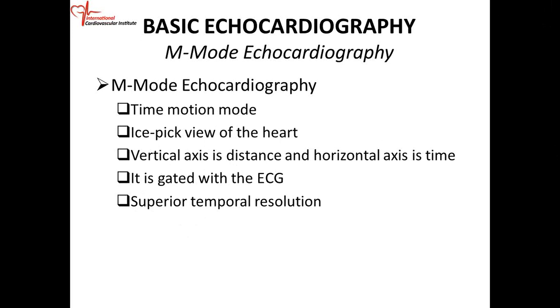So anything that's moving very fast is best to use M mode to look at that structure. So M mode is better for looking at valves because the valves are moving relatively fast. So M mode is better to look at valves than, say, your two-dimensional echo.